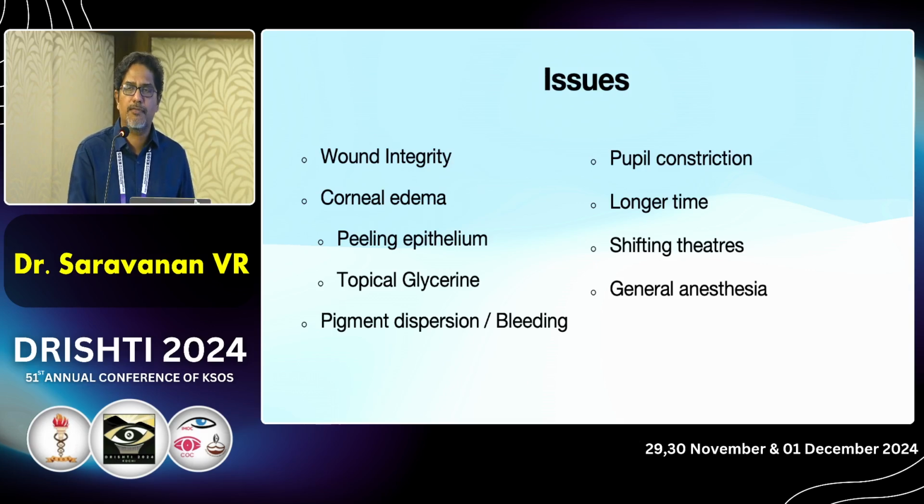So it is better to fill it up with visco before you proceed, and remove the visco after you finish your retinal procedure. Sometimes you have pupillary constriction, like I showed in the previous photograph. You can use iris hooks. Sometimes you also do an iridectomy to enlarge the pupil, especially in patients who have concomitant significant uveitis with synechiae.